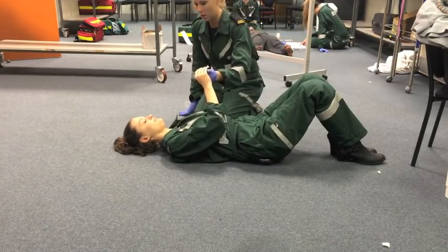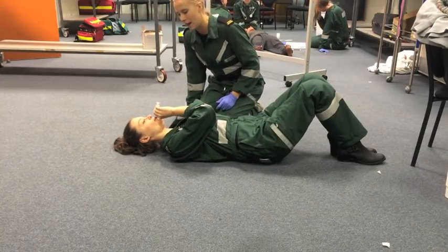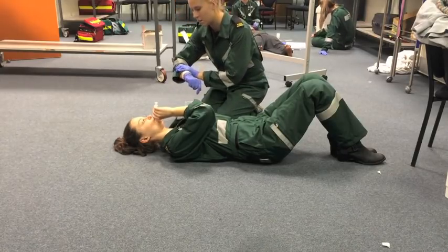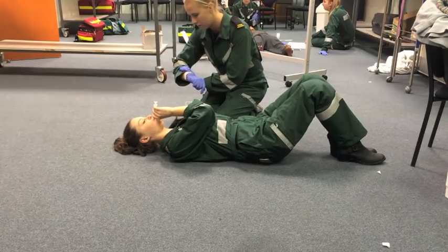Instruct them to place the tip of the syringe into their mouth, with the tip of the syringe pursed around their lips. Whilst holding the syringe firmly with one hand, the patient is instructed to forcefully exhale for approximately 15 seconds, attempting to push the plunger outwards.